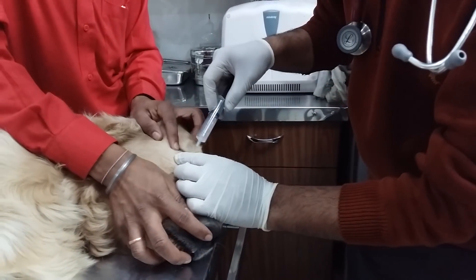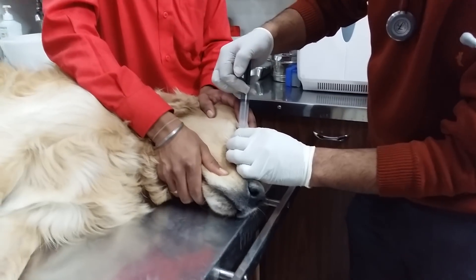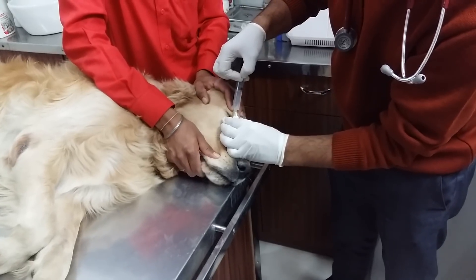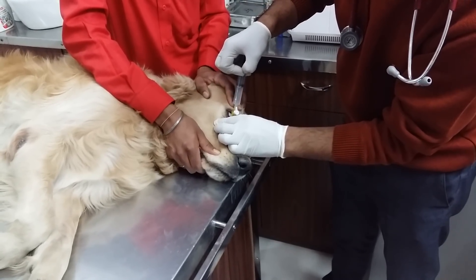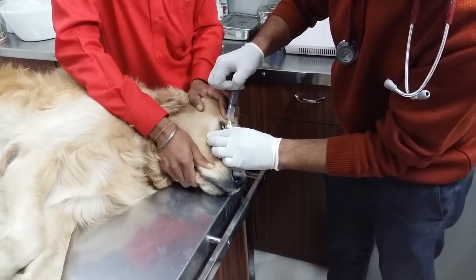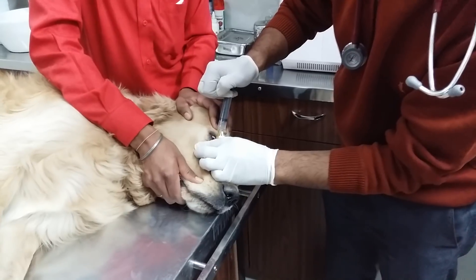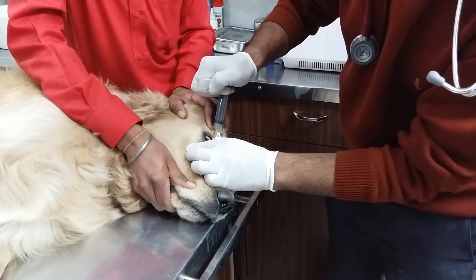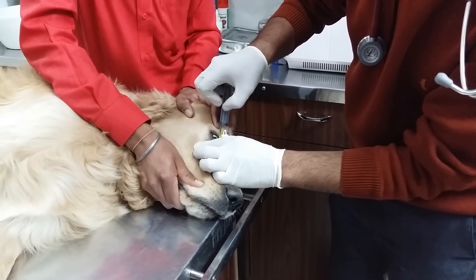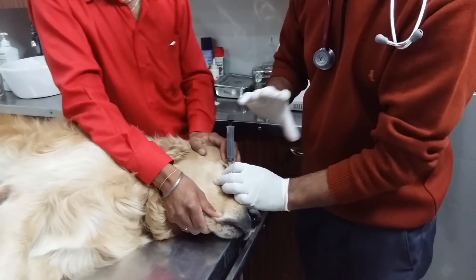Now I will push the Ringer's lactate solution in. Try to see whether the fluid is coming out or not. Fluid is coming from the external nostrils, which means there is no occlusion.